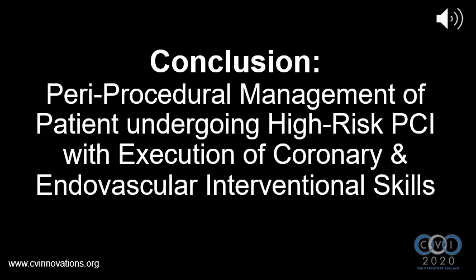This case exemplifies the types of patients we encounter in our cath labs every day. These patients have advanced coronary and peripheral artery disease, and successful and safe execution of coronary interventions requires a thorough and rigorous understanding and knowledge of endovascular and coronary devices, especially device profiles, device deployment techniques, and last but not least, careful review of pre-procedure angiograms and rigorous planning before embarking on these cases.